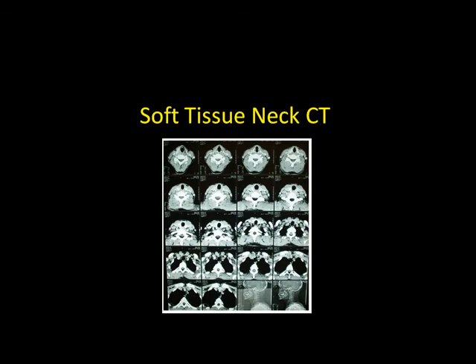Now we'll move on to the soft tissue neck CT. A lot of the information that I've given you before is going to be the same. You're going to be using the same buttons to position, but the patient positioning is going to be a little different. Let's take a look at a little video.